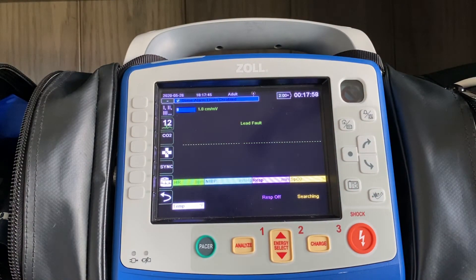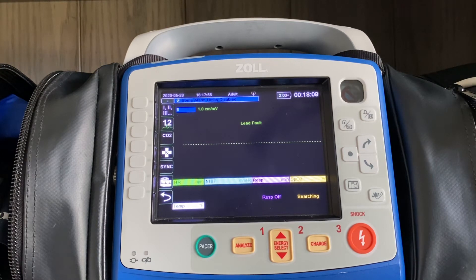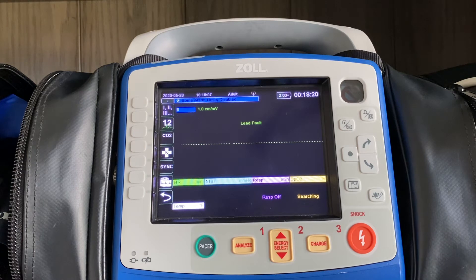What we talked about on a cardiac arrest patient was whether or not you saw a waveform on the screen — that dictated whether or not you had properly intubated the patient. In this case, on a respiratory distress or sepsis call, you're going to see all different shapes of waveforms on the screen, and the shape of that waveform is going to determine what's causing the distress in the patient.